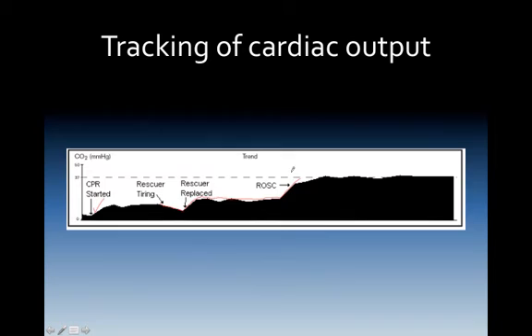There's a good chance that in this area here, this person has had a return of spontaneous circulation. That's because now the pump is assisting the chest compressions in bringing back blood from the cellular compartment and bringing back CO2 with it.